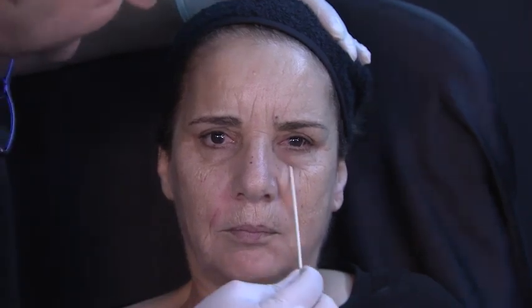Now, we have seen Vital Light, which is my personal option. Look, indirect approach. If you see, can you look at the camera? You see how deep this teardrop goes till here. Yeah. But you have seen that the shape of the tear trough here is more horizontal. Right. We have given support by treating the mid face. So this is important to know. This, okay, is so less deep compared to this other side, and I have not treated yet.